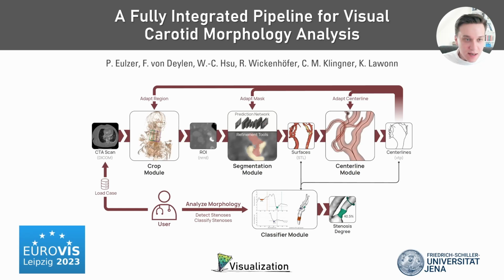I'm with the University of Jena and I will talk about a fully integrated pipeline for visual carotid morphology analysis today.